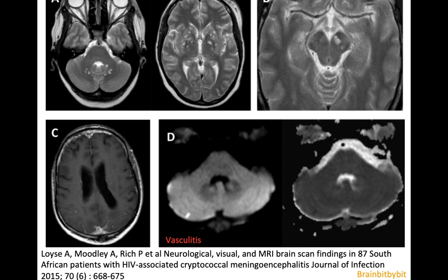Because of the perivascular involvement, you can also get a vasculitis-like pattern with small infarctions, as you can see here on these diffusion weighted and ADC images, in the right cerebellar hemisphere.